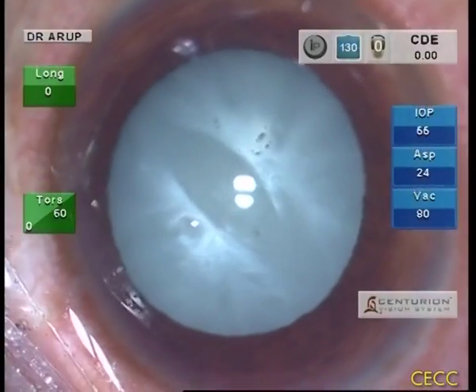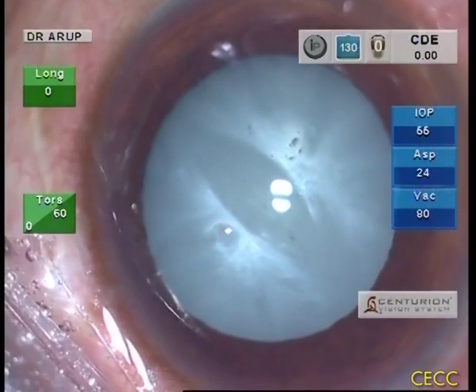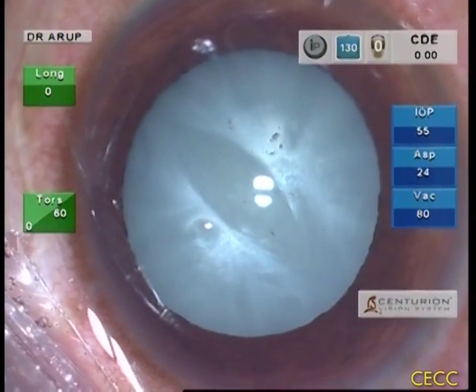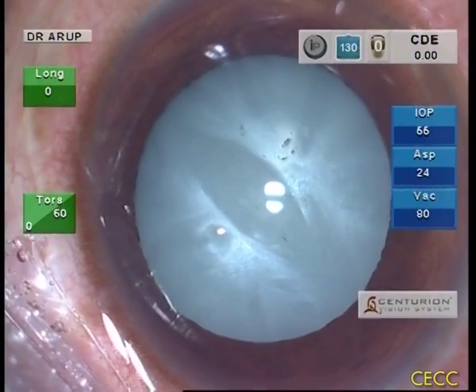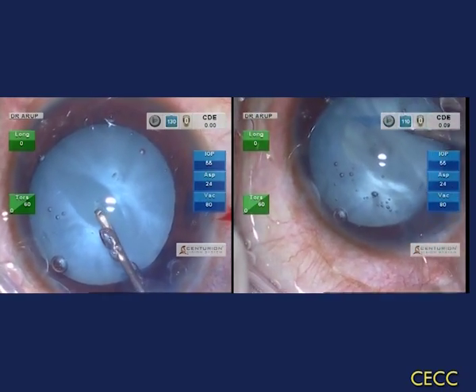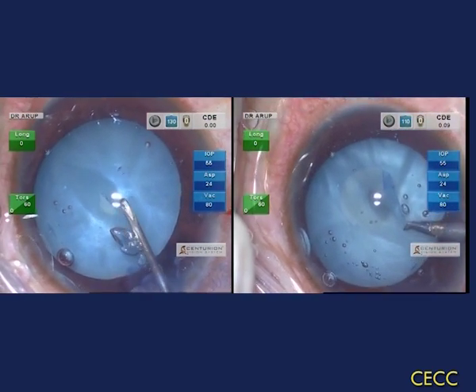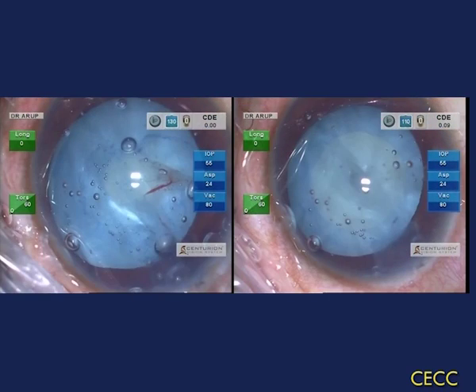This 32-year-old female patient has an intumescent cataract in her right eye with very high intralenticular pressure. The central bulge of the anterior capsule is very clearly seen. She had earlier undergone pars plana vitrectomy plus silicone oil injection a couple of years ago. RHEXIS is expected to be a big challenge in patients like this, and in this video we are going to demonstrate how to effectively surmount the challenge using a two-stage RHEXIS strategy.